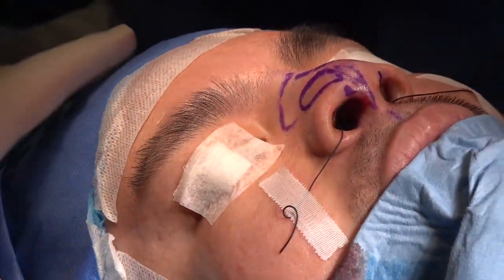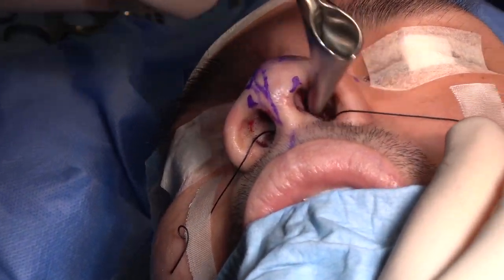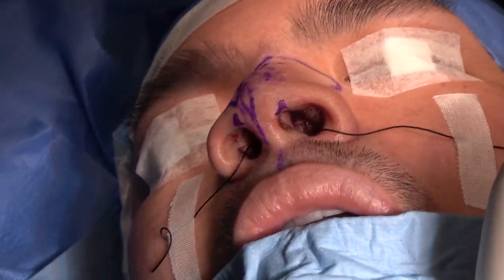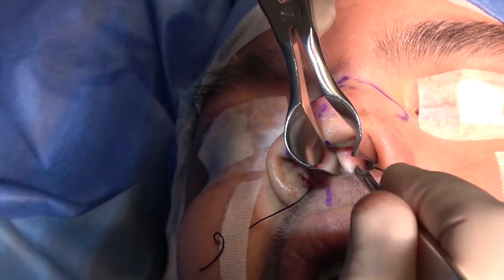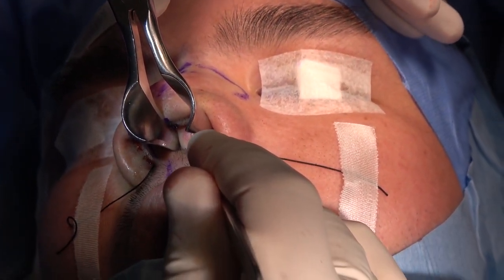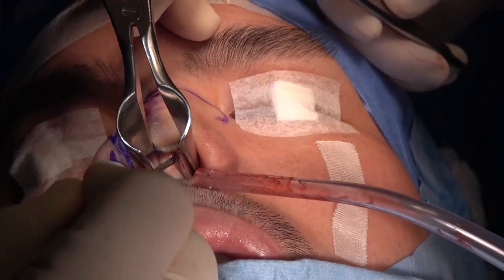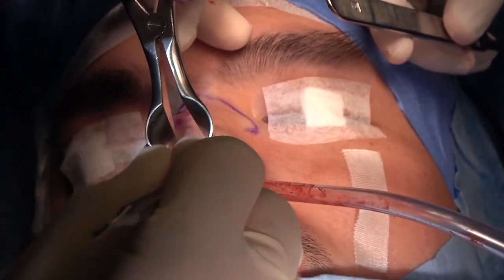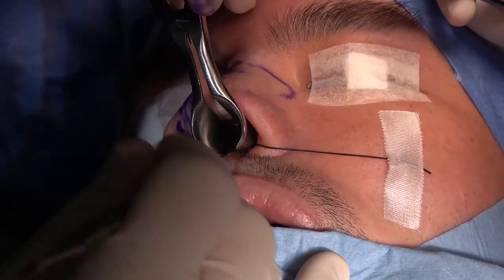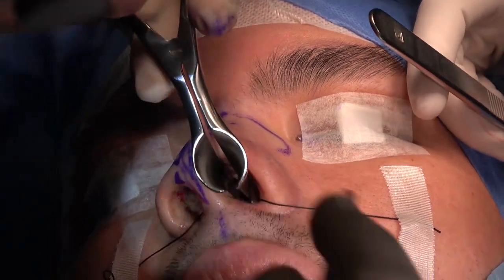Okay, so start now obtaining the septal graft first. We push the nasal back. The patient actually is having a laryngeal mask. Few millimeters behind the caudal septum, we're trying to get to the right plane. Once you are on the right plane, your dissector will run very smooth, very quickly all the way through. And you see now the white cartilage. Can you see the white cartilage there? Okay. All the way down.